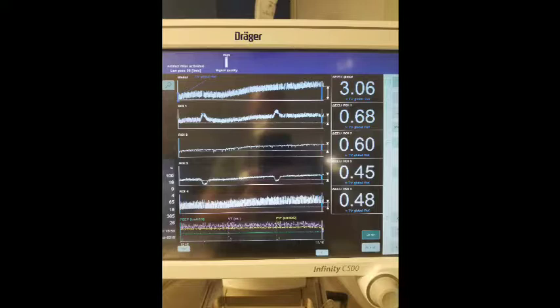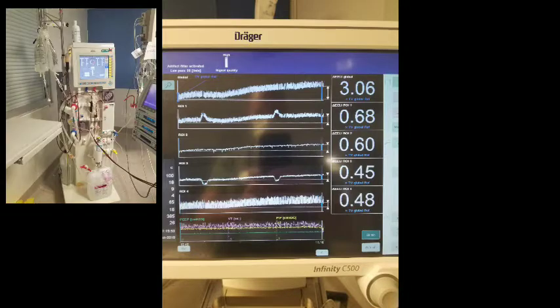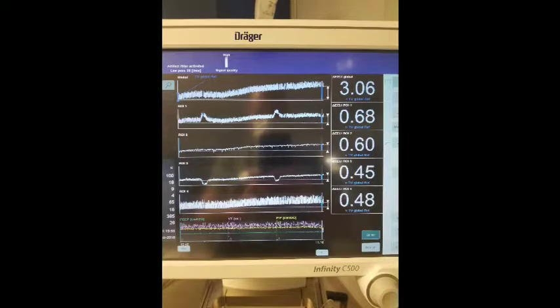When you have a patient that is on dialysis or about to start dialysis, when they're getting fluid removed, that fluid has an influence on our tomography, right? Because that patient, for example, the one that I'm about to show you is 3.5 liters positive, and this tracing that you see, if you look on the top, it's 3.06. There's a great improvement in impedance, a great increase in impedance.